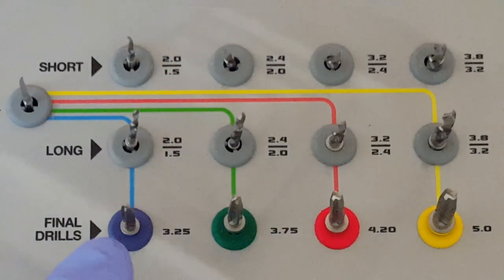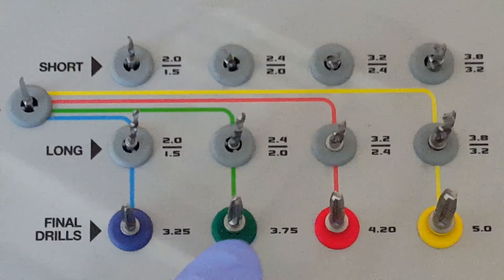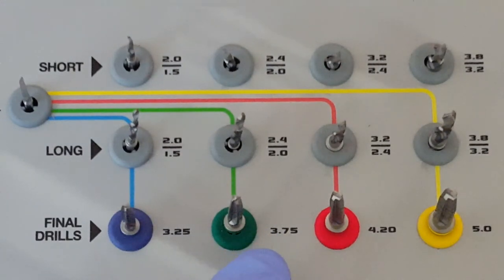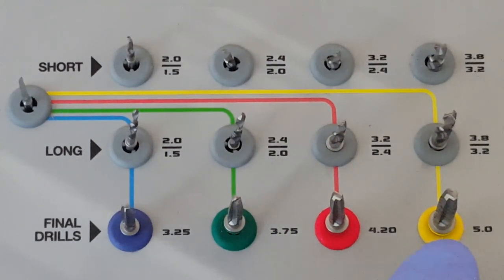The blue color and 3.25 millimeter implant has a unique narrow platform. And the green 3.75 millimeter, red 4.2 millimeter diameter, and 5 millimeter yellow color all have the same standard platform and are all compatible with this, and utilize the same prosthetic components.